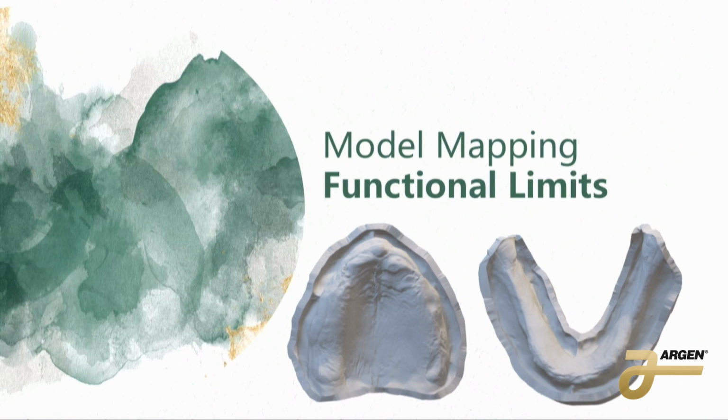We just don't have the time for that. But what I need to really explain is the functional limits. There are rules to when we're setting dentures that are different to crown and bridge. This is a piece of plastic that is not stuck in the bone. So we have to work with it in different ways than we would work with crown and bridge because these are not stuck in the bone. So we have to make sure they can eat, chew, laugh, blow out birthday candles without this moving around.